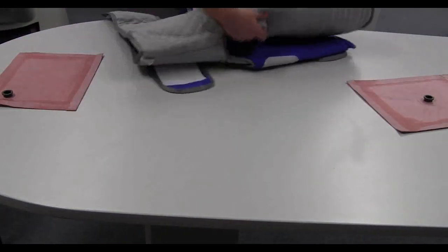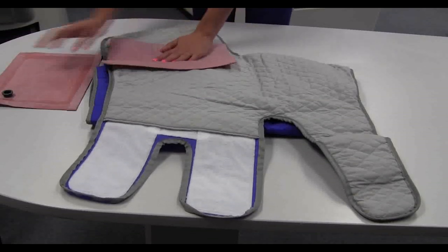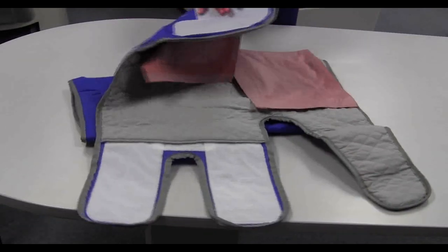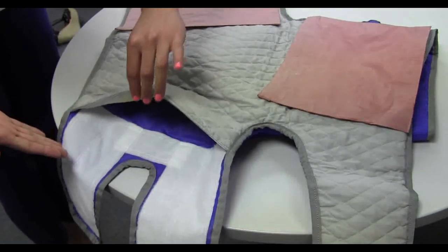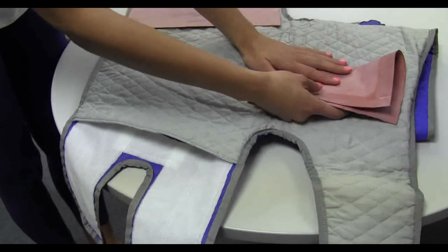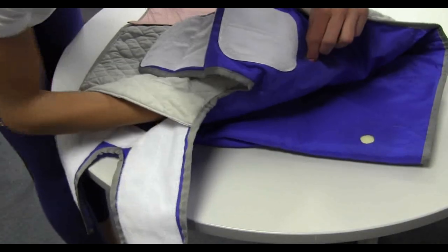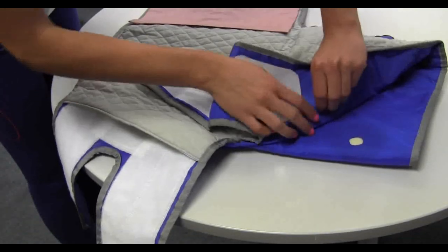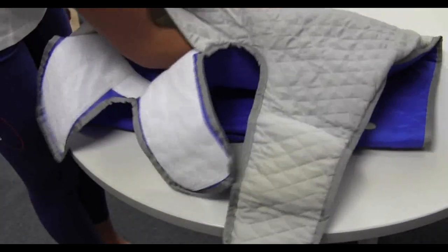Fold the upper thigh buttocks cuff in half, exposing the lining. Position the bladders for insertion. Open the hook and loop binding, exposing the inside of the cuff. Take the upper thigh buttocks bladder and fold it in half, taco-ing the bladder. Insert it into the cuff, aligning the bladder inlet with the cuff inlet opening. Push the bladder inlet through the cuff inlet opening. Fold the bladder out along the buttocks and flatten it out.